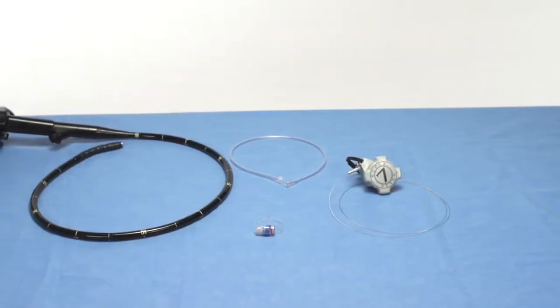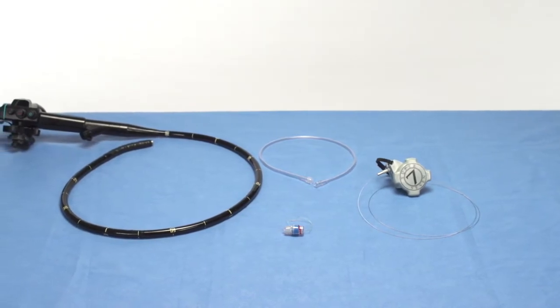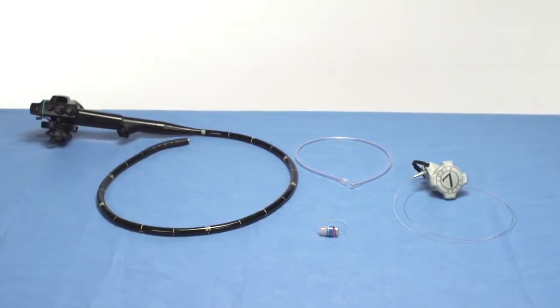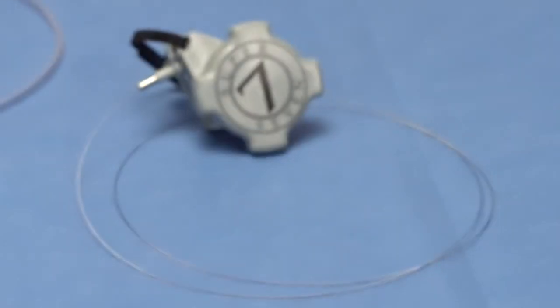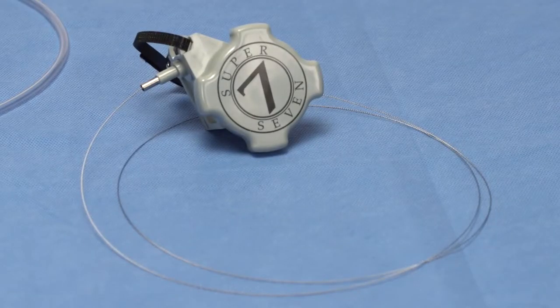Let's begin. Upon opening the package of the Speedband SuperView Super 7 device, you will find two components: the ligating unit and the handle unit with tripwire and scope fastener.